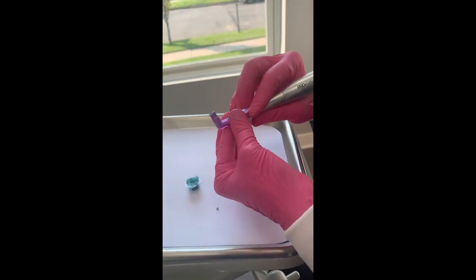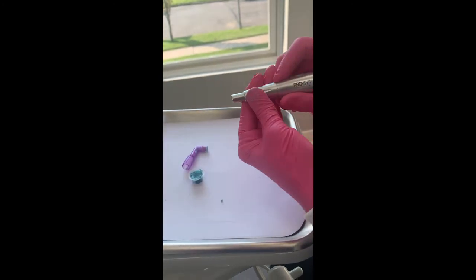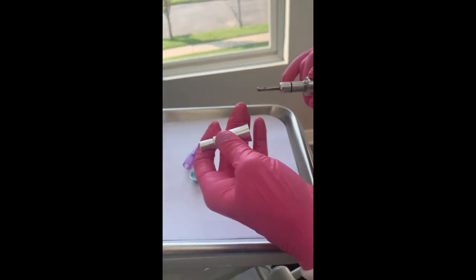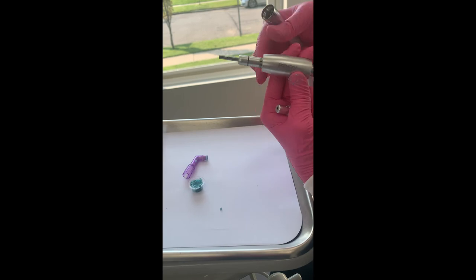When you're all finished, the handpiece comes apart, the nose piece comes off, you can unscrew it, and the entire handpiece is fully autoclavable.